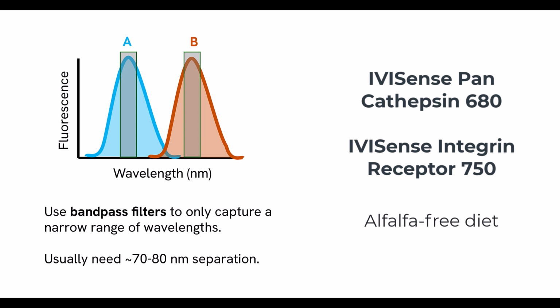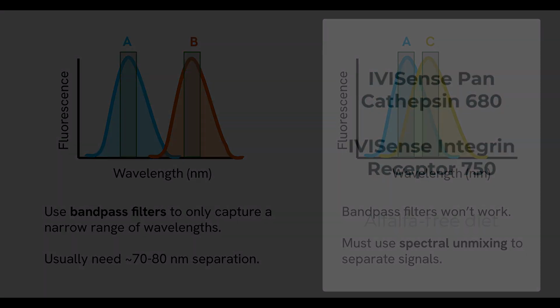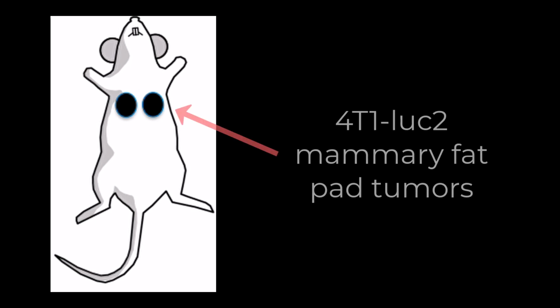Let's discuss experimental design. Imaging fluorescence activity in deep tissue sites, such as the lungs, is challenging as a starting point for assessing the utility of fluorescent agents for in vivo imaging. Therefore, to test specificity of our near-infrared agents with this tumor line, we will start with a simpler model to optimize our parameters before moving into a deep tissue model.